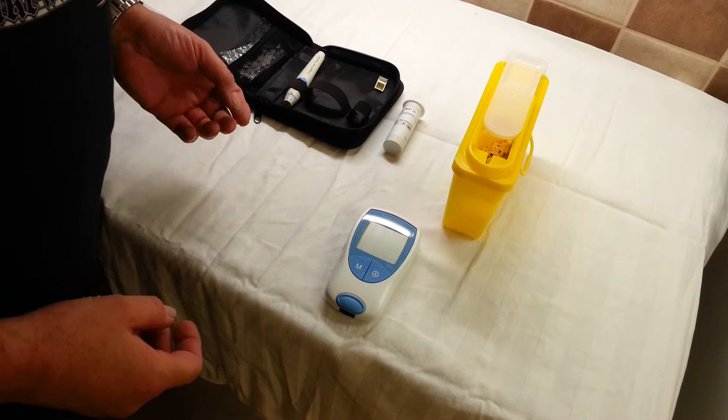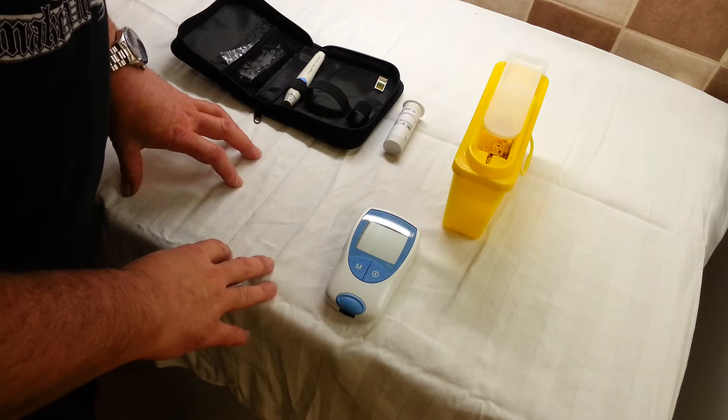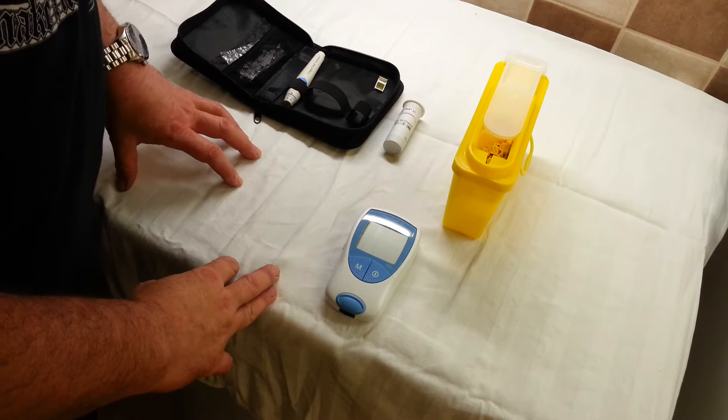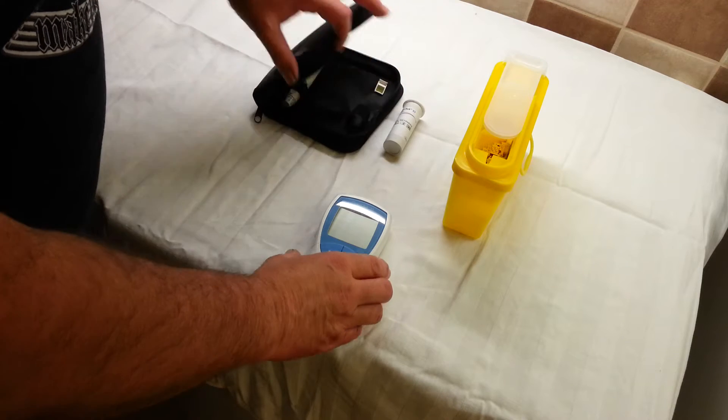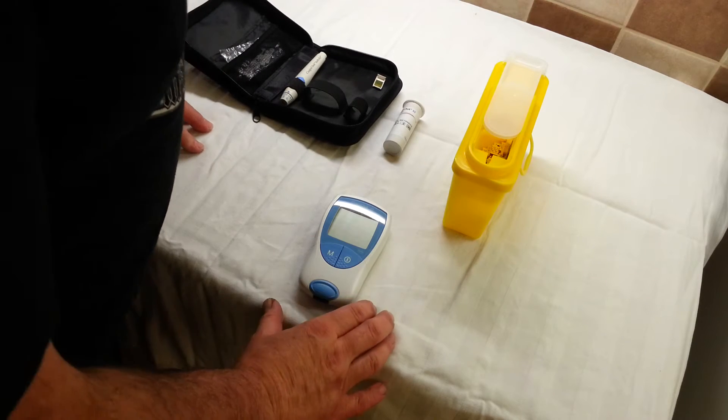As promised, I'm just doing a short video about how I do my home warfarin testing. Basically this is the kit, which in my case is a Roche Coaguchek XS.